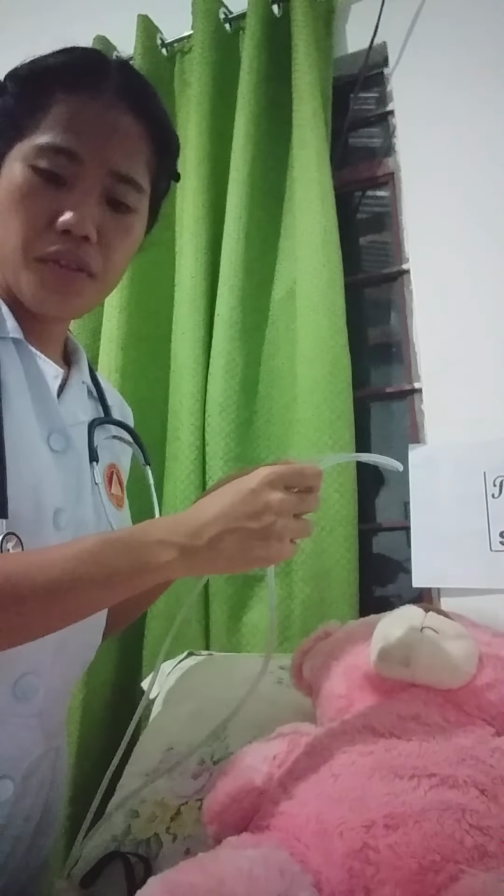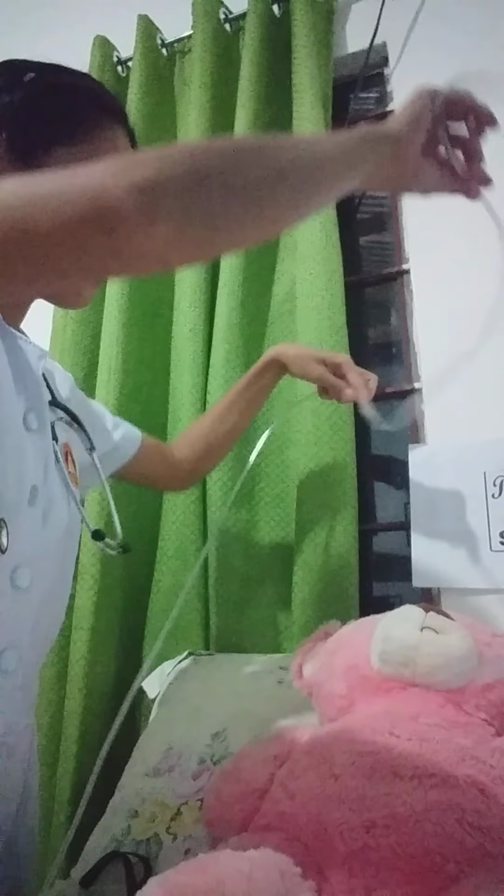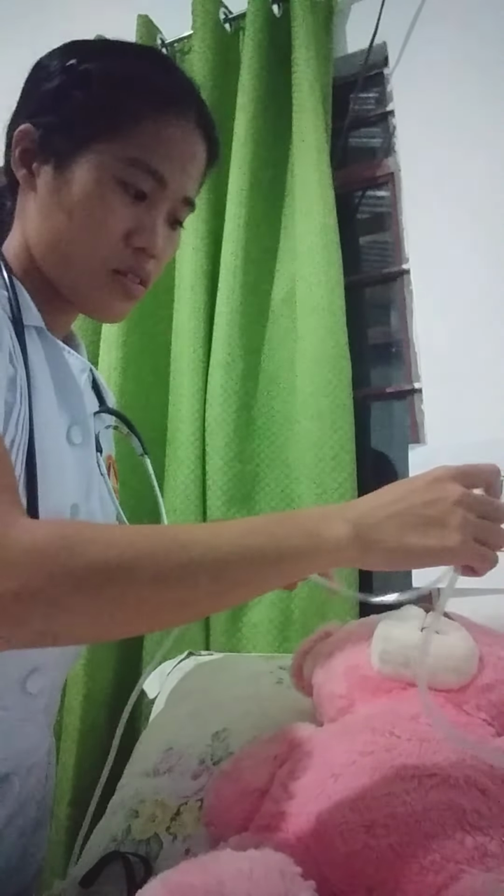And then hold the nasal cannula properly, positioned with the prongs curving downward. Like that.